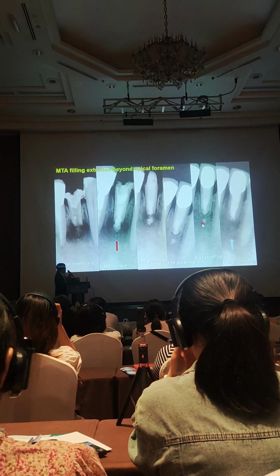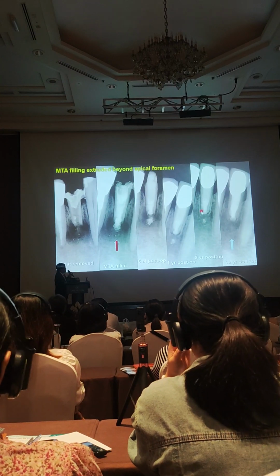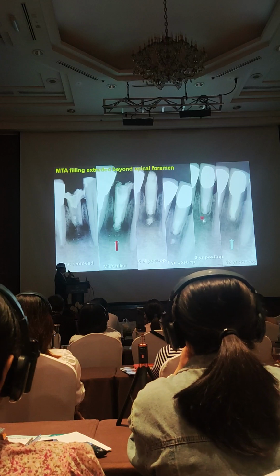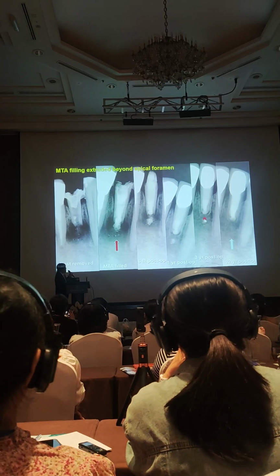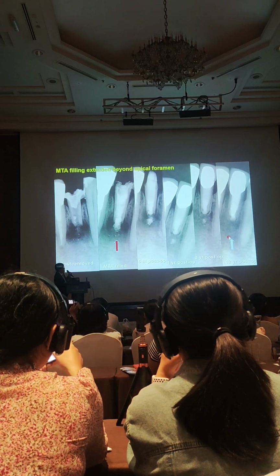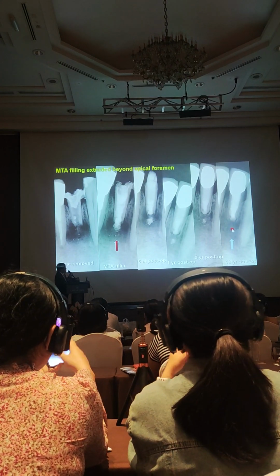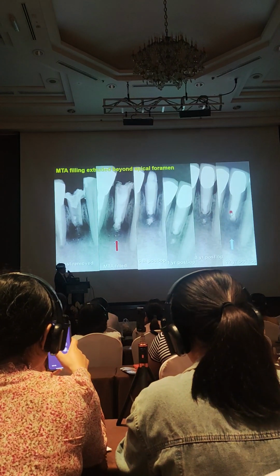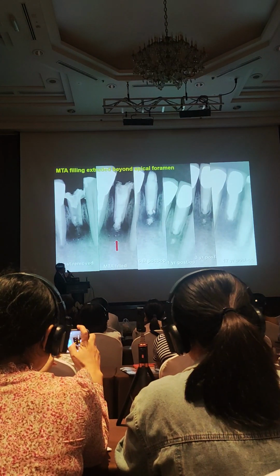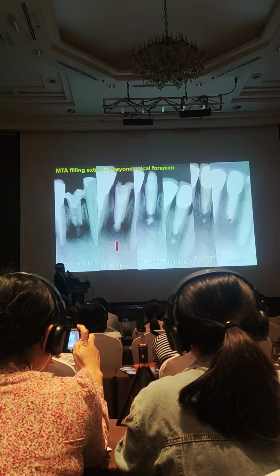3 years after the retreatment, you see the complete periapical healing. And the root was actually longer than before I retreated this tooth. And this is 12 years post-op showing nice periapical healing. This is 17 years post-op showing the same.